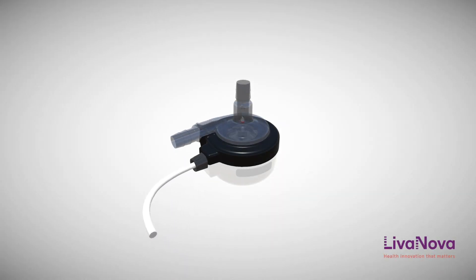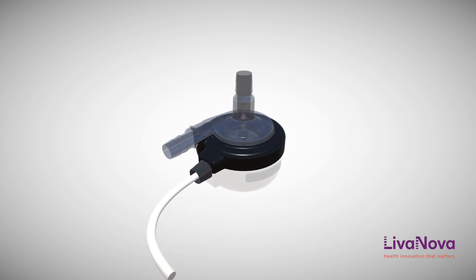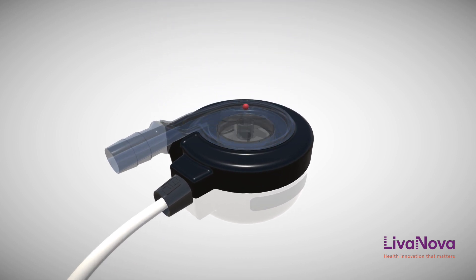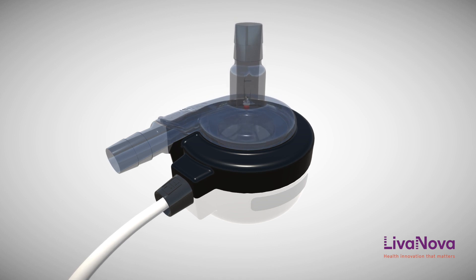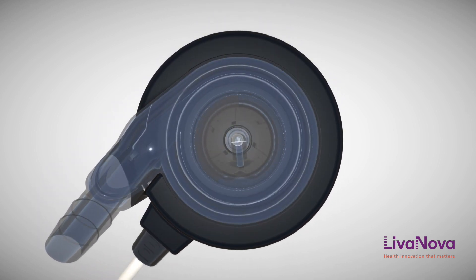The LifeSpark pump is a non-pulsatile centrifugal pump capable of delivering up to 8 liters of flow per minute, with an operating range of 2000 to 7500 revolutions per minute. It is a single-use centrifugal pump which uses a rotating impeller to cause blood to flow.